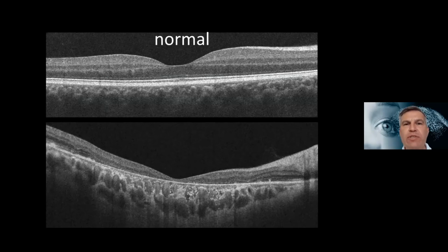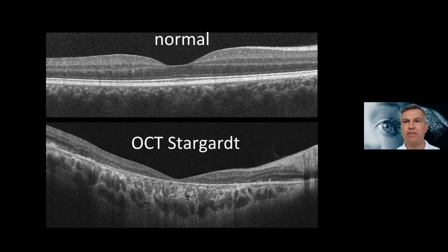In the normal eye, you see this depression. So I call that the Maloca depression because it makes me always happy. And this is the macula. It's a foveolar depression. And this is the only depression that makes me really happy. In the lower image, you see the depression is really huge and we have an atrophy. And the RPE has gone. So we have a visual on the choroid, and the choroid is really thick. And this patient is suffering from morbus Stargardt.